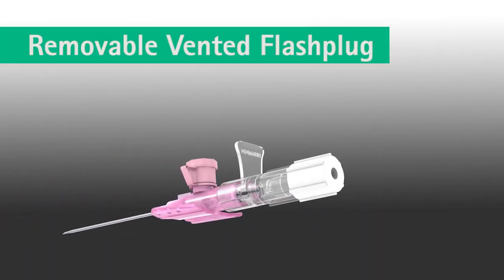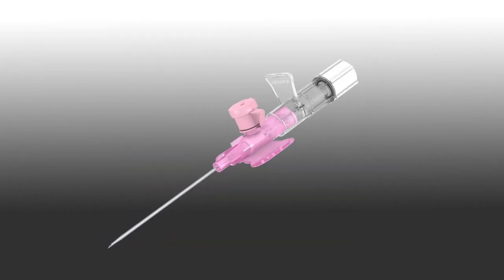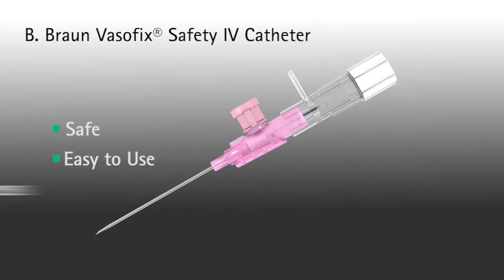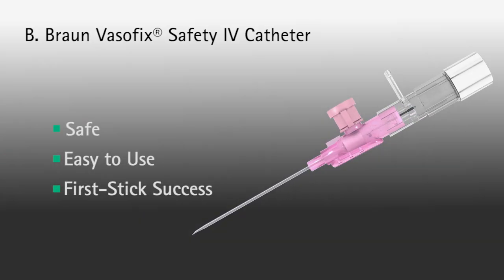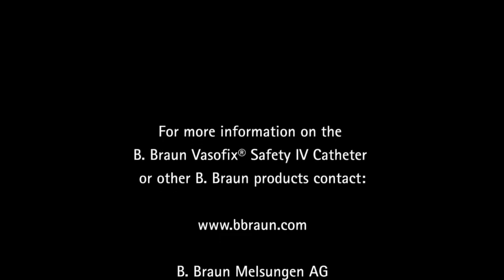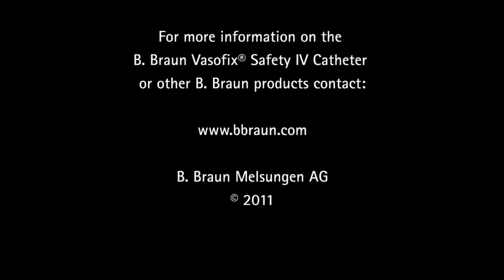The removable vented flash plug provides additional versatility to the Vasofix safety IV catheter. The flash plug can be replaced with a syringe or blood collection access device prior to insertion. A B. Braun Vasofix safety IV catheter — safe and easy to use, resulting in first stick success.